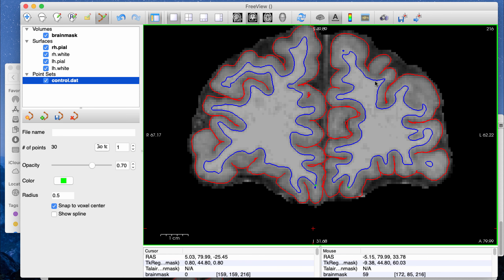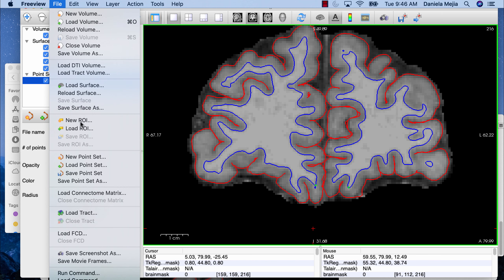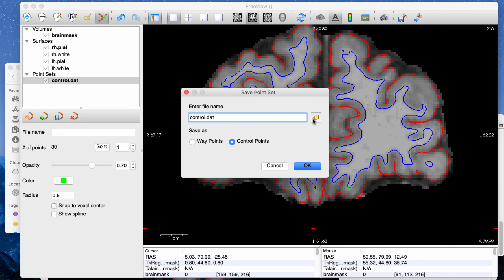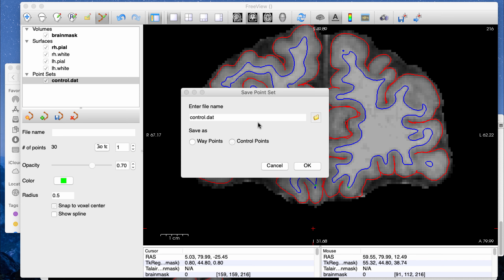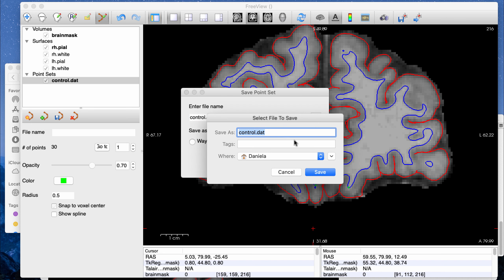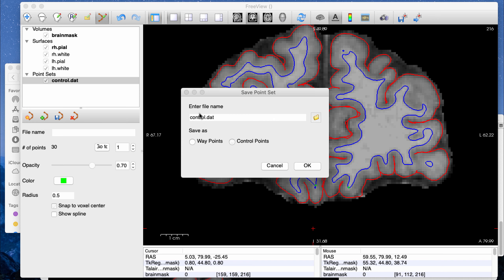When you're done making control point edits, you want to save the control.dat file that has all your points labeled on the brain. Go to File > Save Point Set and make sure the control.dat file is saved in the correct folder. FreeSurfer will only look for this file in the tmp folder of the subject. I found that on Ubuntu and also on Mac, the default folder location is actually incorrect, so you have to manually make sure control.dat is in the correct folder — the tmp folder inside your subject's directory.